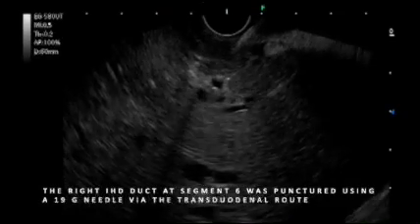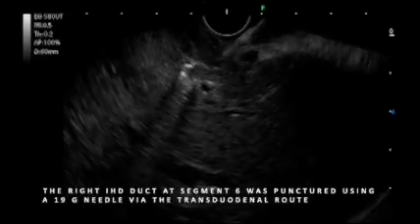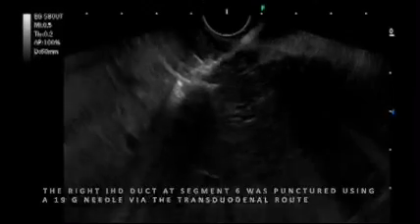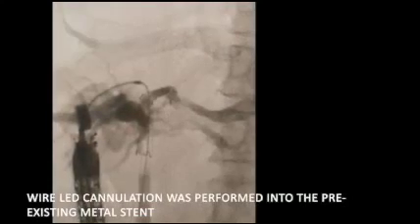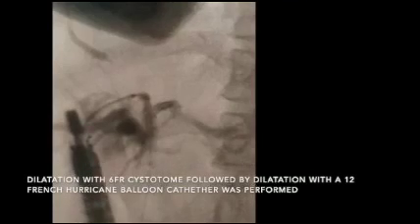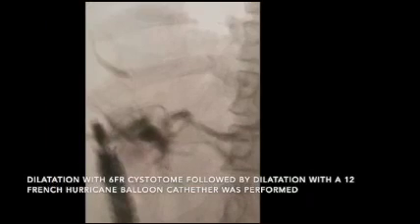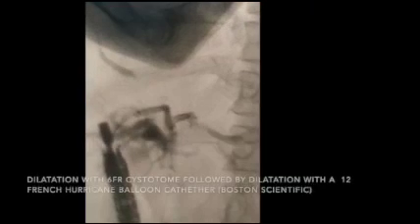Subsequently, the right intrahepatic duct at segment 6 was punctured using a 19-gauge needle via the transduodenal route. Contrast demonstrated a right intrahepatic duct stricture, and wire-led cannulation was performed into the pre-existing metal stent, and dilation with a 6 French cystotome followed by 12 French hurricane balloon catheter was performed.